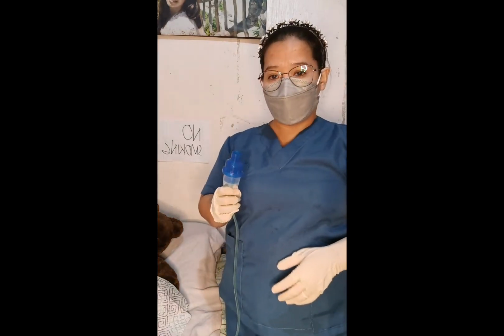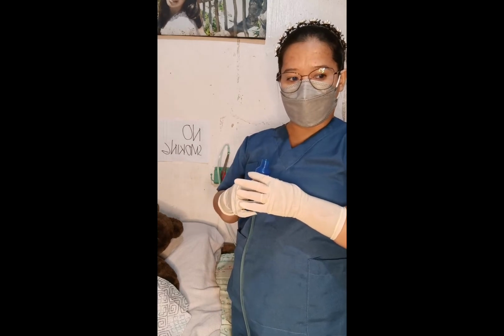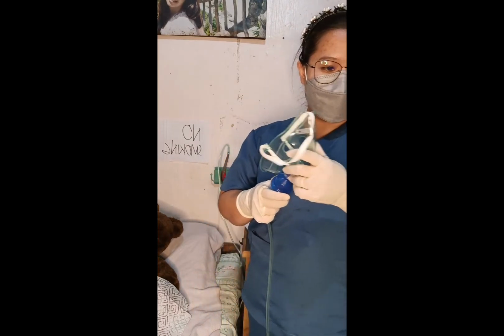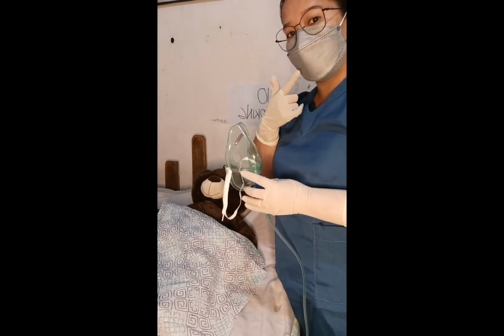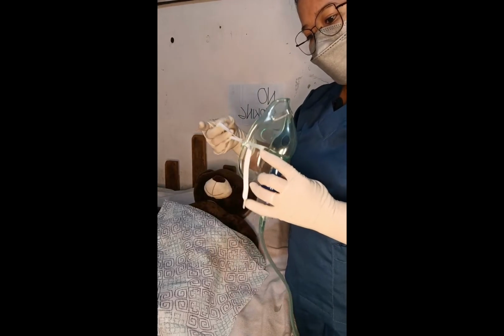So we will attach all the equipment needed for the mask. So this is the mask. We will attach it. The oxygen mask should cover the nose and the mouth. So this is how we do it.